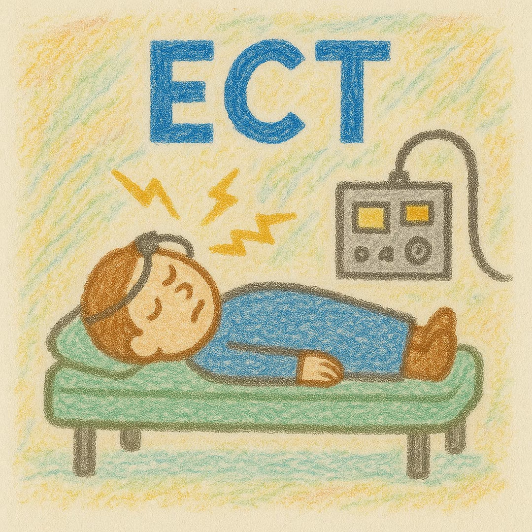Bitemporal placement seems to be more effective, or at least can achieve clinical efficacy faster than the right unilateral treatment. A number of studies have shown that they can be equivalent if right unilateral is dosed higher, but that right unilateral might take a few extra treatments compared to bitemporal, but they can both achieve the ultimate end state, the same clinical outcome at the end.